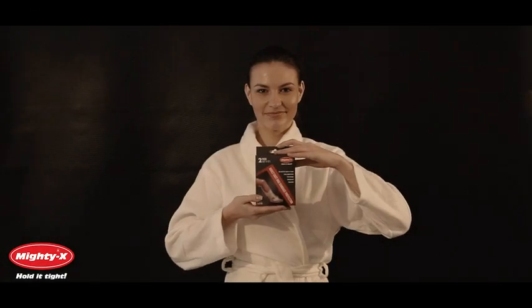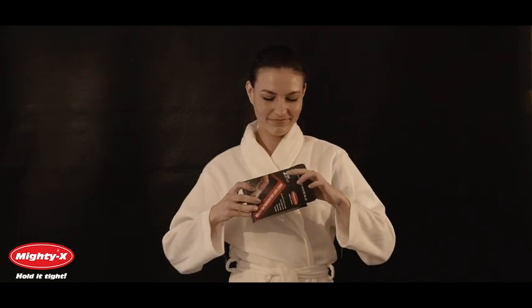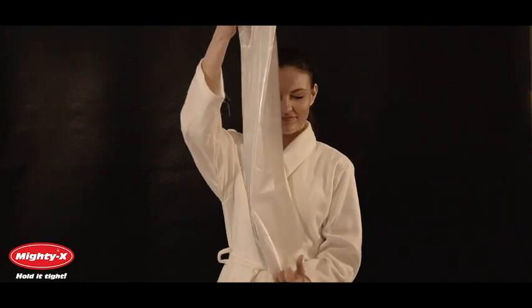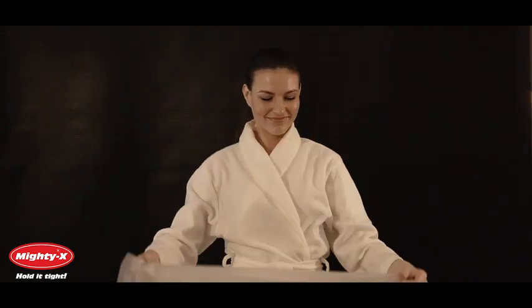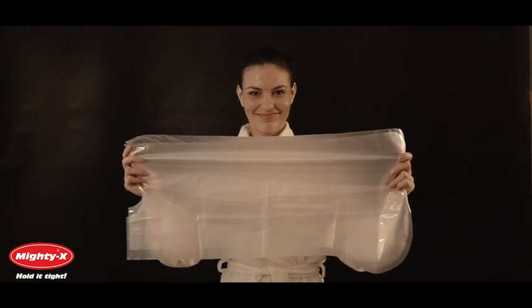Mighty X Leg Cast Covers were created to shower comfortably in spite of leg injuries. We offer our covers in sets of two, but each cover can be used multiple times if handled carefully. They are made from a durable, elastic and waterproof material, which will keep your bandage or cast dry. They provide safe and comfortable showering during the recovery period.